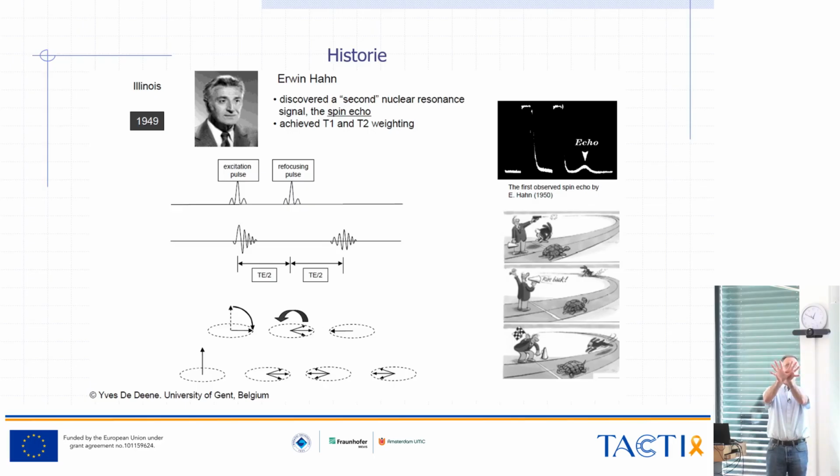And what you then do with your second pulse, if you put it correctly, is rotate everything around. That's the command, now come back. You're applying this pulse along this direction, and that will rotate the whole magnetization.